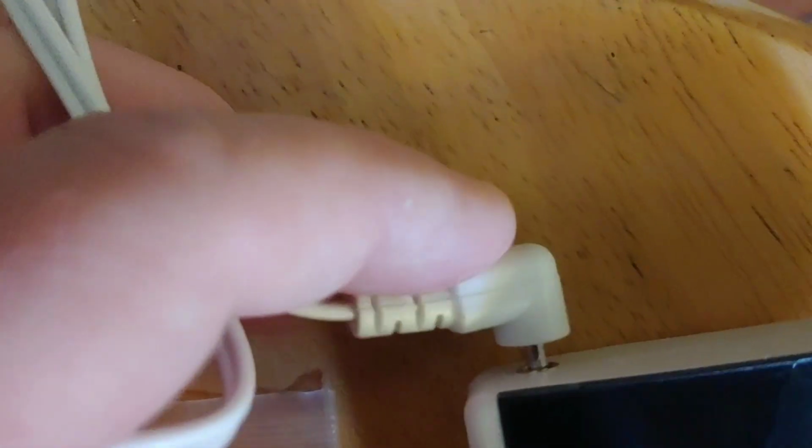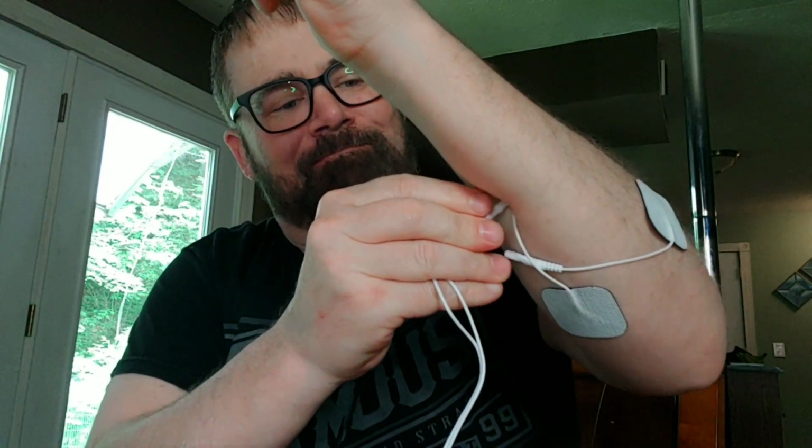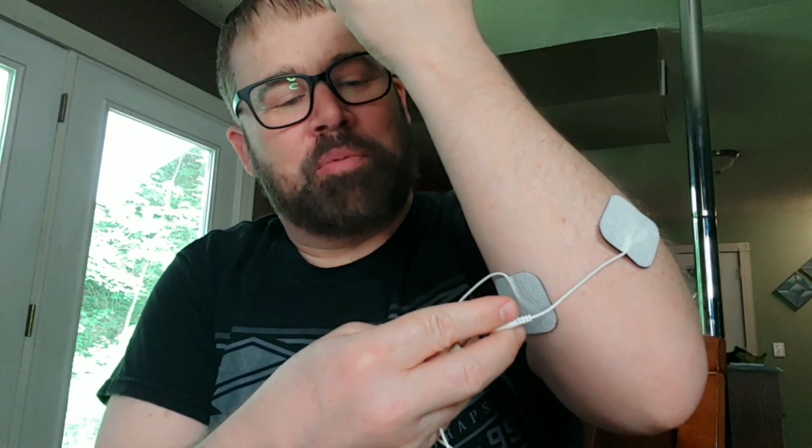Okay, so we're going to use the cable going to the left side. So I'm going to use this one. It's going to be controlled by that meter right there. These things are a little more difficult to do on myself than I expected. Probably should have hooked them up before I stuck them on, because I can't use my other hand. Okay, note to self. If you're using an electronic stimulation unit on yourself, hook them up before you put them on yourself.